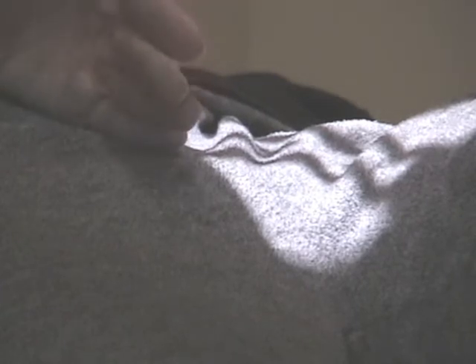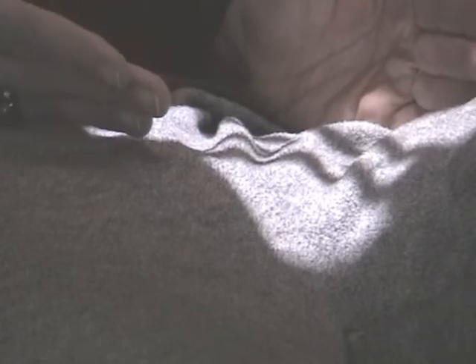The edge of the light is right there. And the lateral border, I don't know if you can see from the camera perspective, but this edge of the light is barely skimming her body. So side to side, I'm happy with that centering. And when she bends her leg for me, I can see that I'm right in the crease. So without palpating personal reference lines, I have put the hip to the center of the film.